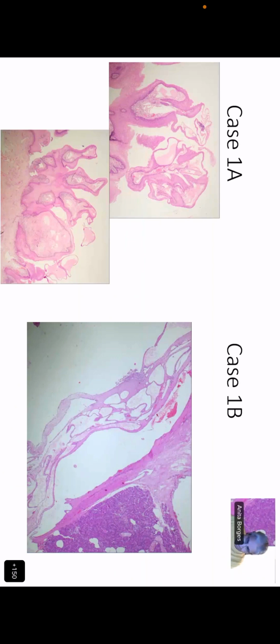No, ma'am. Now I would tell that this is not a papillomatosis. How would you describe this? Ma'am, now I would tell that it is an exophytic growth having a stratified squamous lining, and there are some cystically dilated spaces in the subepithelial region. Yes. And it's not just some cystically dilated spaces.